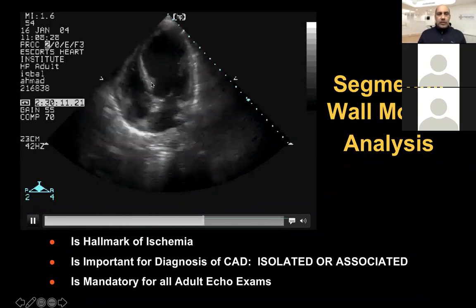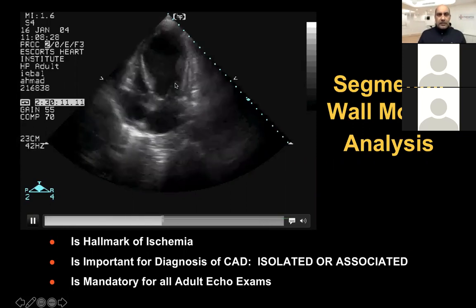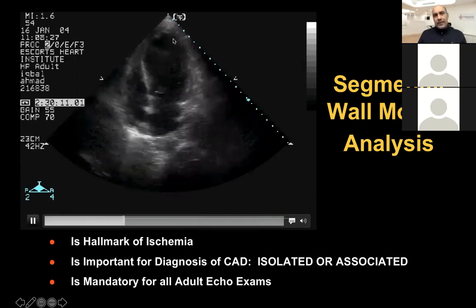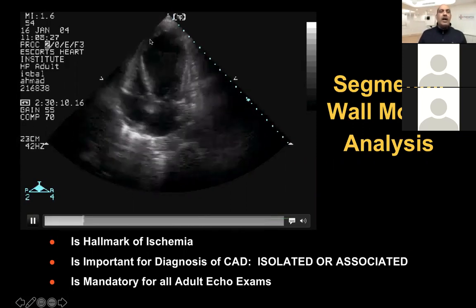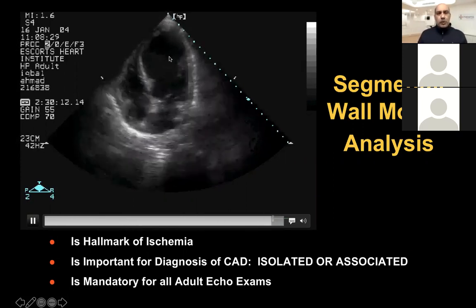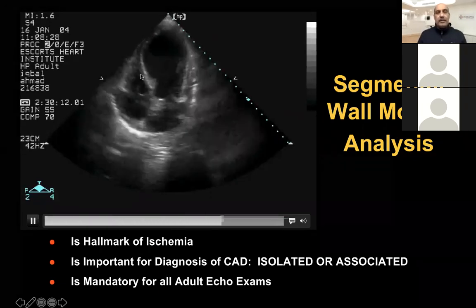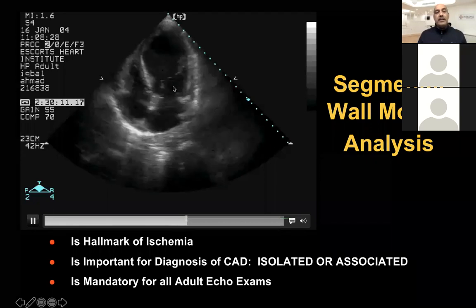In this left ventricle, you can see the basal segments towards the mitral valve are contracting reasonably well. But if you look at the apex, it's hardly contracting, rather, it's going out in systole. So this is a particular portion of the myocardium which is akinetic or dyskinetic or not contracting, whereas the rest of the myocardium is contracting well.